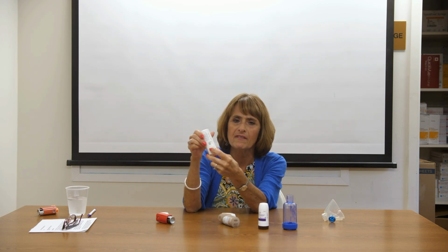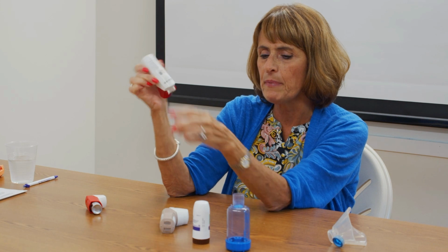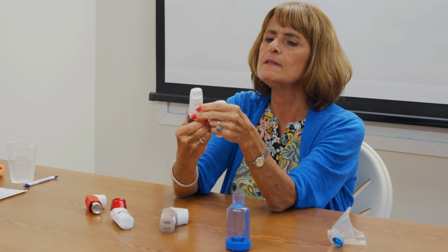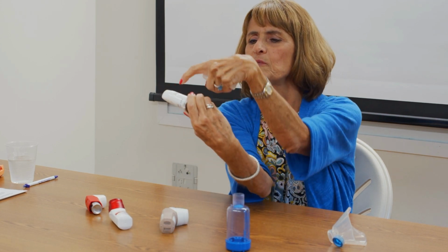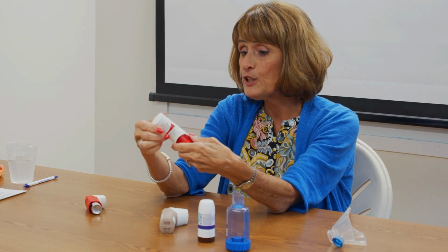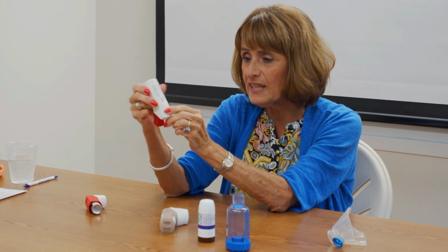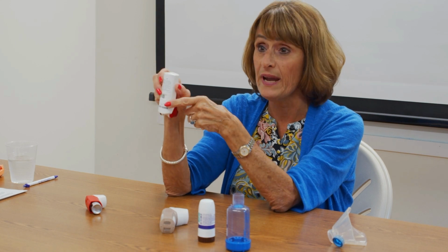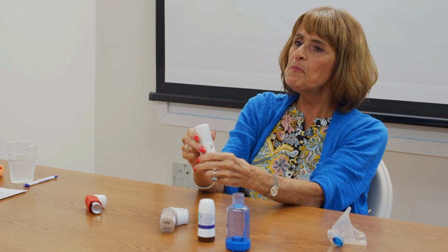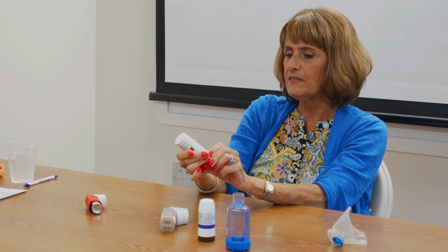All of these inhalers have numbers on the back which indicate how many doses are left. They're either on the back or on the Pulmicort one is, let's see, it's in here. So sometimes you have to look for them, but there are numbers, and that tells you how many doses you have left. It's really important to know when your inhaler is running low. And usually, I think most of them, the numbers are in red when it gets to the point where your doses are running low. So at that point, you should make sure that if you need a refill, you call our office so that your child doesn't run out of the inhaler.